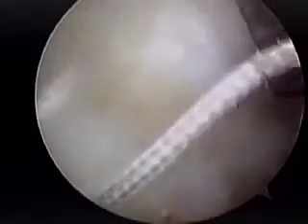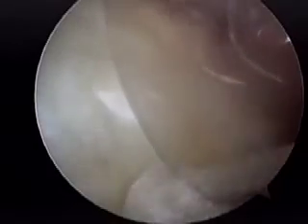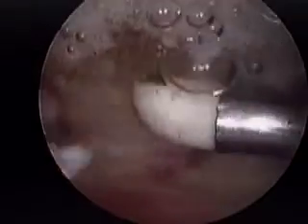And then we performed the first knot, a sliding Duncan knot. Now we are putting a lot of compression, as we can see on the video. And once the knot was tied, we just had to cut it. And then from the posterior portal, in a retrograde fashion too, we passed another bird beak through the infraspinatus and passed the second suture in a retrograde fashion too. Then the knot was done, and this is the final construct in which we can see that a very strong reinforcement was performed in the posterior superior cuff.